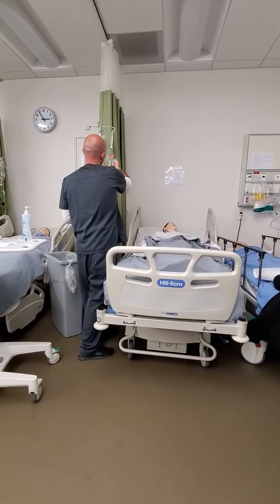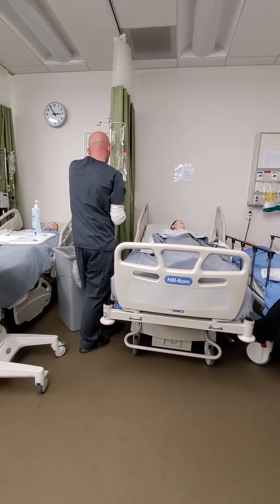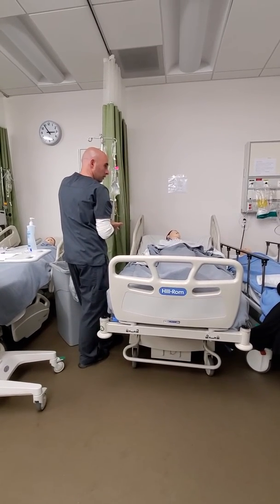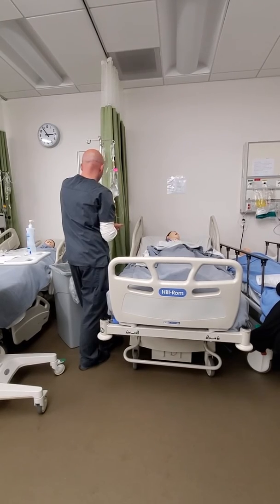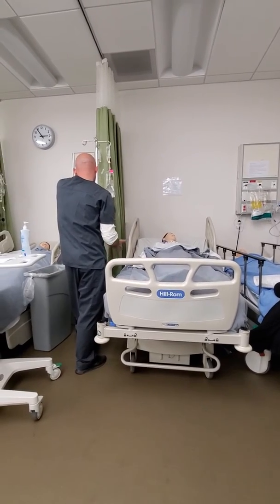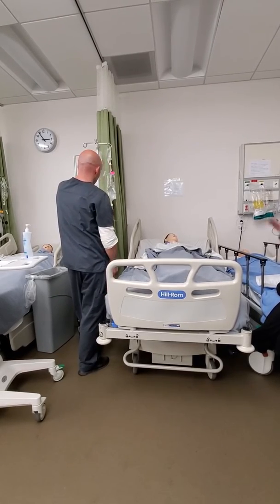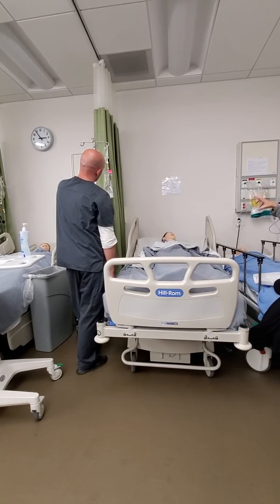But what are you gonna program first into the pump? I'm gonna program the drug I'm administering. What do you wanna program first? The infusion rate of the drug. Before that? You asked for this. Yeah, I did, and I'm regretting every second of it. I don't know. Primary first, with the TKO. Yeah, so the flush, because it needs to flush after. So you wanna always program your primary first and then your secondary.